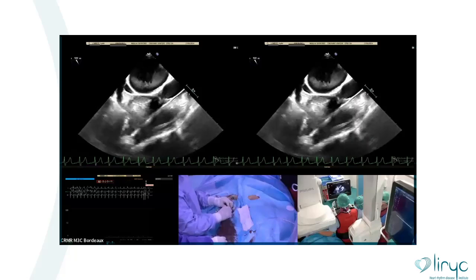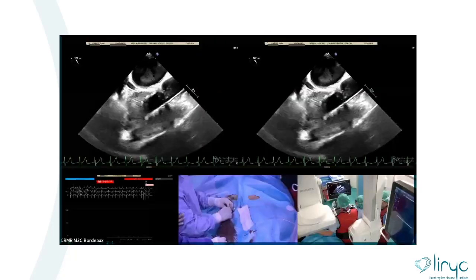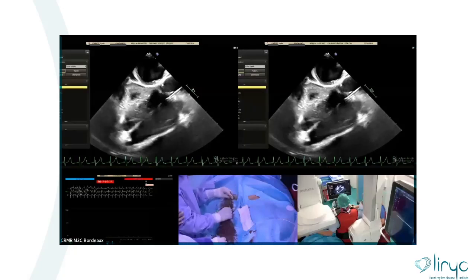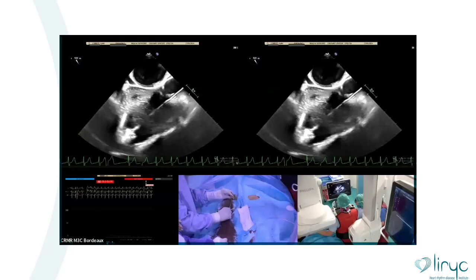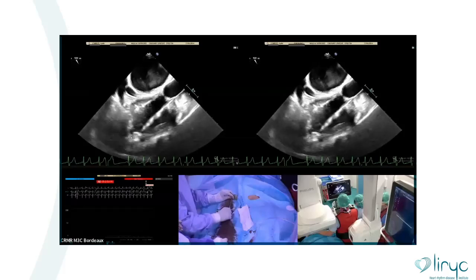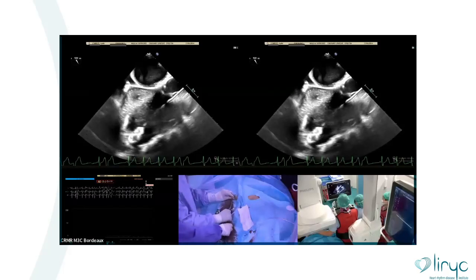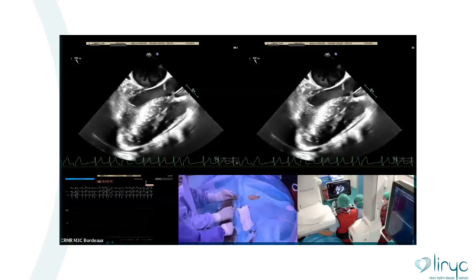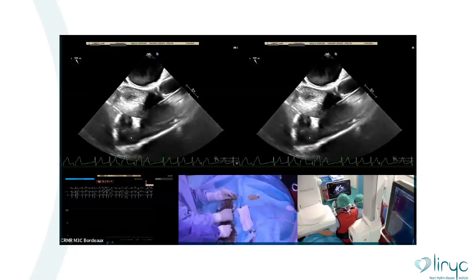I guess you won't see it. Pulling it back, do you feel resistance? No resistance. You have resistance, something else. I think I see two discs, guys. Okay, advance the discs. Good job. That's good, you agree.